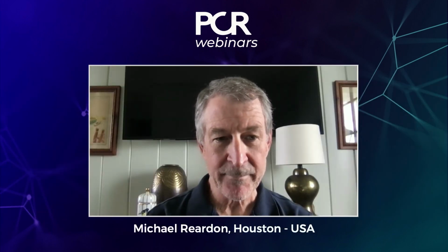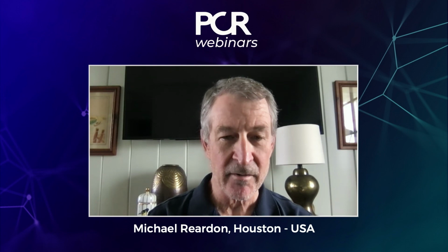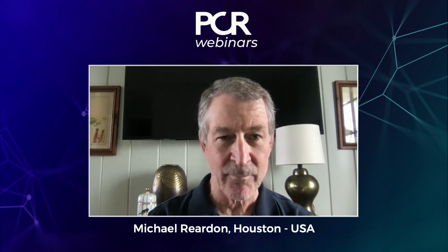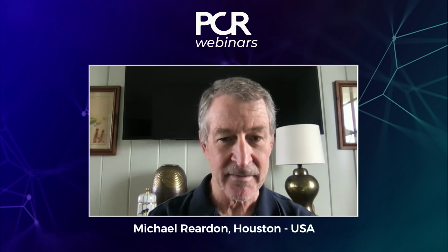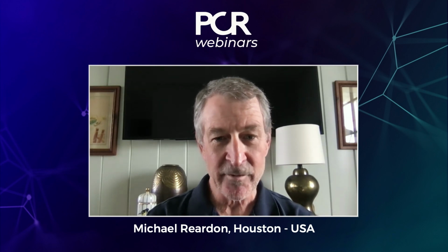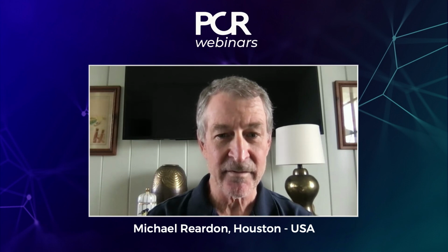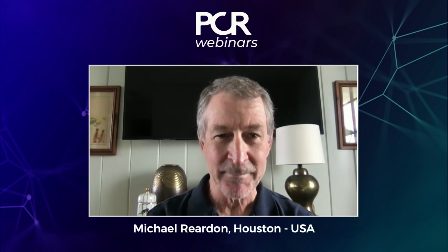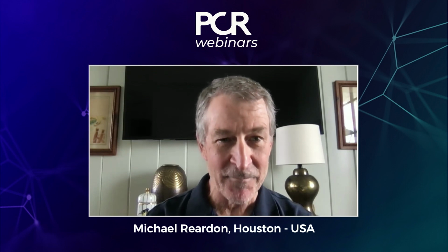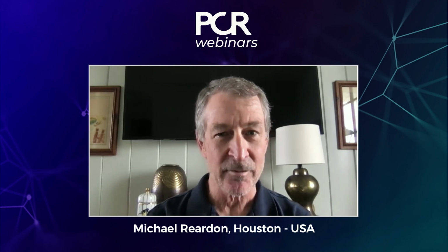Well, I think we're very close to that, Lars. We used to be happy if we left without moderate PVL. Now, if it's more than trace in my lab, we feel like we've done something wrong. Our pacemaker rate is consistently in the single digits, no matter what valve we're using right now. And so far, the durability seems to be matching that of surgical valves. And whether surgeons like it or not, we are going to see younger patients coming in asking for TAVR. Because in Houston, Azim, I see people coming in their 50s wanting TAVR, and I'm often having to explain to them why they are so much younger than me. They might do better with surgery.